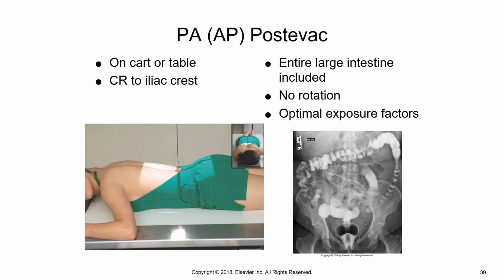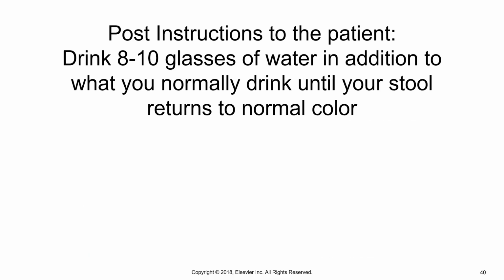So once you're done with the post-evac image, then, like with any contrast study, we tell the patient, you need to drink 8 to 10 glasses of water in addition to what you normally drink until your stool returns to normal color. So that could be that same day, that could be the next day. We don't tell them to increase their fiber. We don't change anything else about what they do except the water. As far as their diet, unless they were told otherwise, they can resume a normal diet once the exam is done.